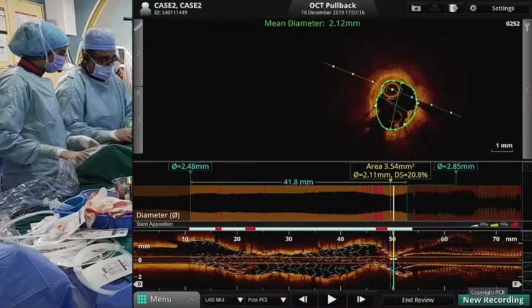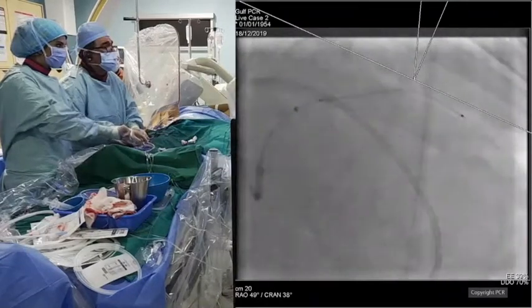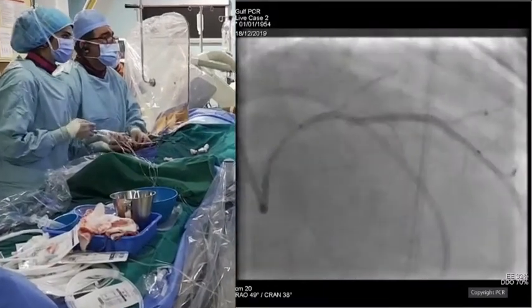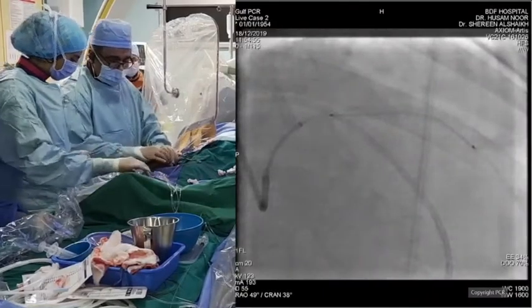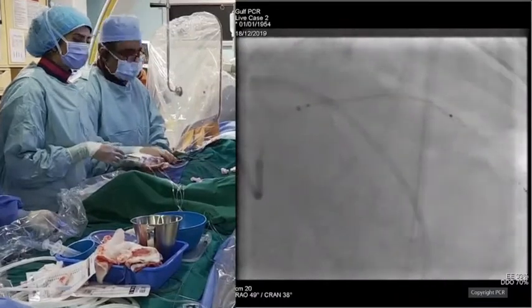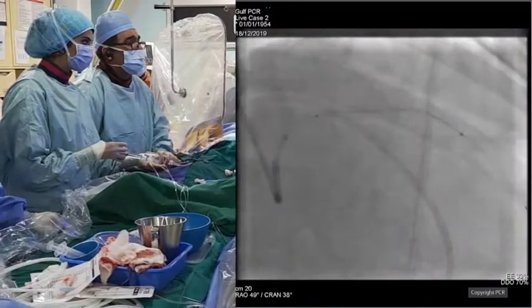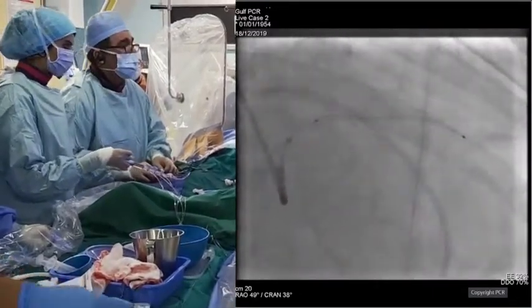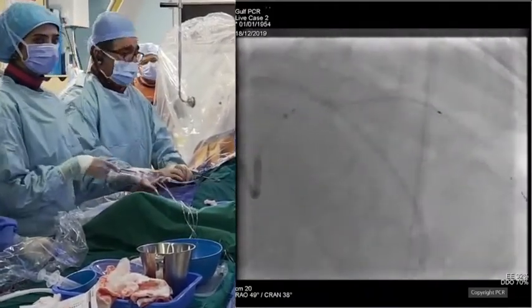I think it's important because obviously it looks like it is at the place where you had that calcium nodule where you have some problems of expansion. It's the proximal part. But otherwise, it looks really, really good. So the job that probably you have to do is just in that proximal part of the stent. But that is the segment that you have inflated with a 4.0 balloon, right? Yes. I haven't imaged that yet, Ibrahim. Okay, I'm going to put the guideliner in there and be ready for the last OCT. Okay, ready? Another run.